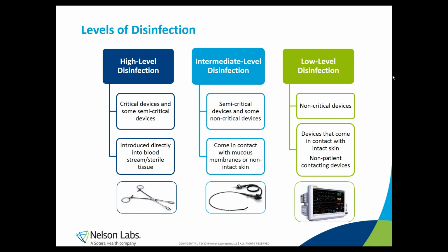Then we have semi-critical devices. These traditionally come into contact with mucous membranes or damaged skin of the patient. Devices belonging to this category may require intermediate level or even high level disinfection. Flexible endoscopes and urinary catheters are examples.